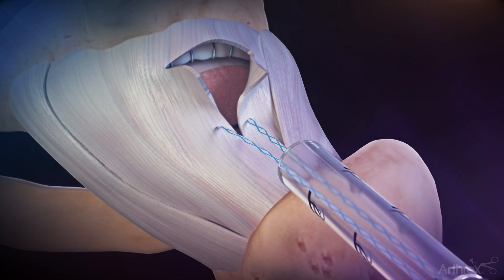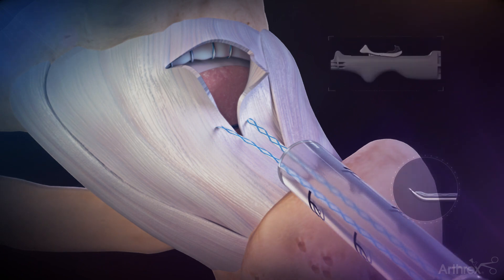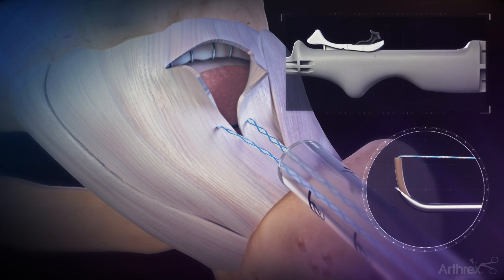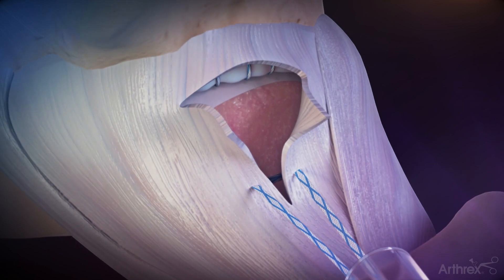Once the suture passer is outside of the arthroscopic cannula, release the suture by pushing the white sliding actuator forward, exposing the PEEK tubing, and then push the black switch forward to expose the nitinol jaws and the suture. Tie and cut the suture tails and repeat these steps for the additional stitches.